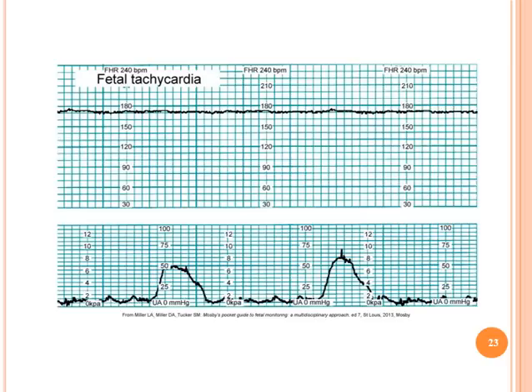This is figure 15-10 in your textbook, and this is showing fetal tachycardia. If we look here, it looks like the fetal heart rate is going at about 170. And we know 110 to 160 is considered a normal fetal heart rate.